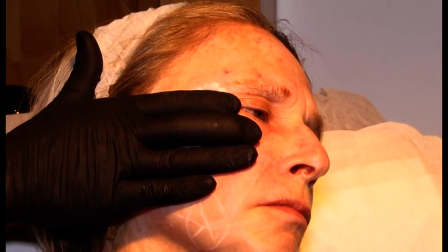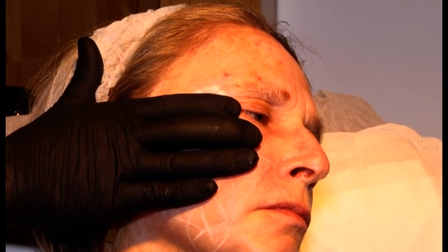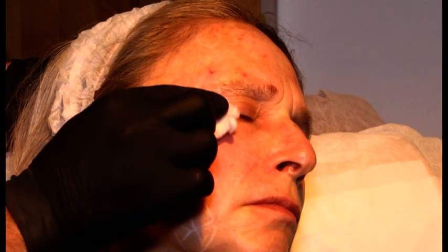Yes, because we're going to do nose augmentation. A cannula, please. A 22 gauge cannula, please. So remember, guys, for the nose, this is the second area of most association with vision loss after fillers, right? The first being glabella, second is nose augmentation. So with nose augmentation, we have to know what we're doing. So again, we have to know the anatomy.